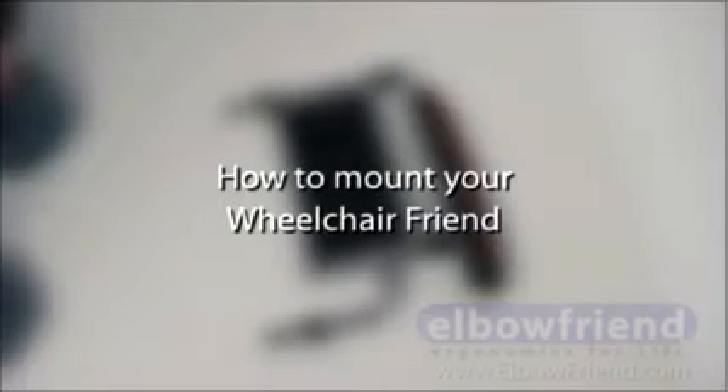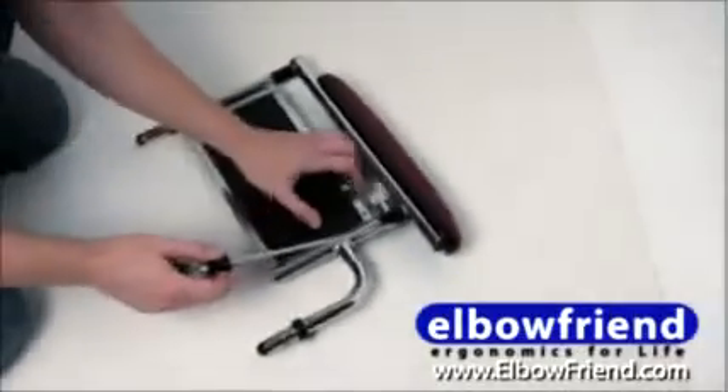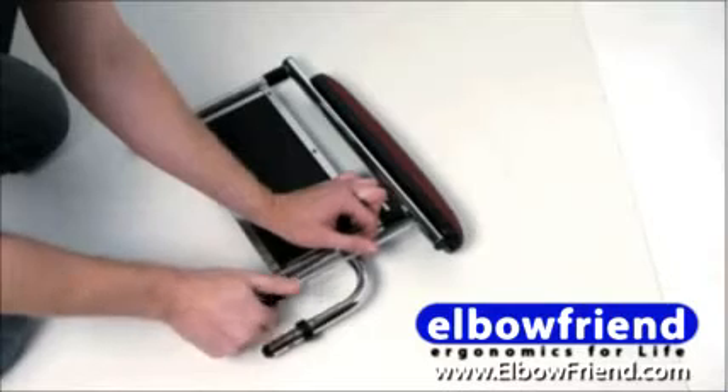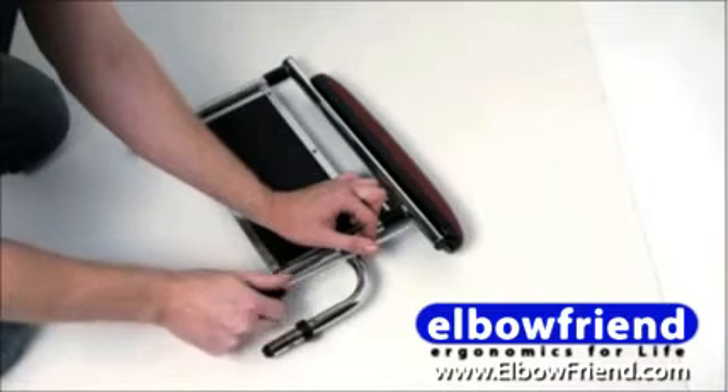This tutorial will show you how to mount your new Wheelchair Friend. First, remove your old armrest cushion by unscrewing the two bolts on the bottom.